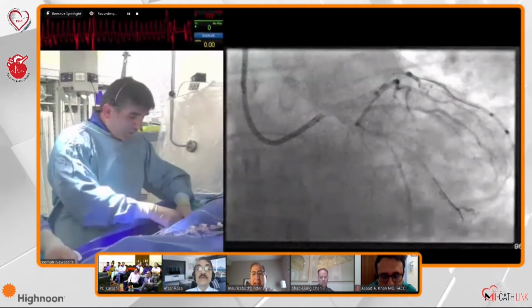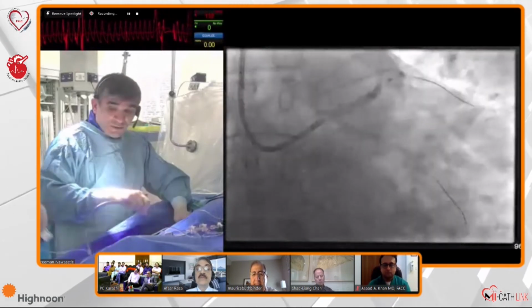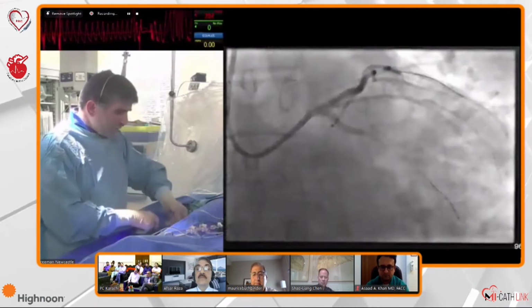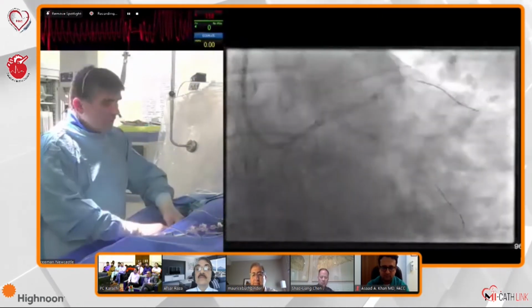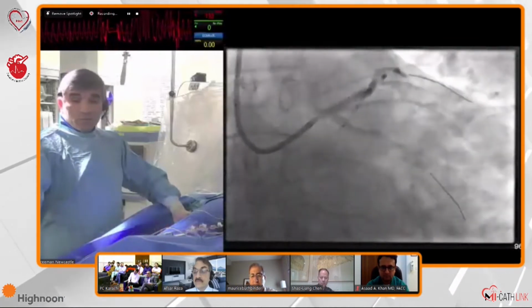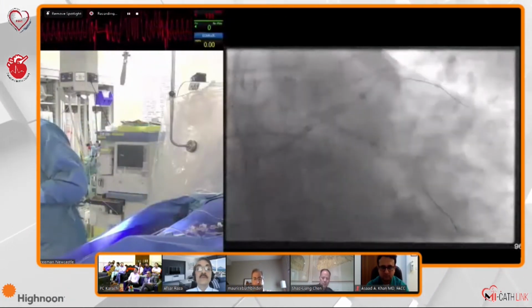Okay, good. Do you have an NC? Did you put it with an NC? That is an NC. They went to 20 atmospheres and rupture. So I'm going to take the angioscalp again and do the left main, and then we'll take a stent because I think it's ready. The stent will take the 3.5/10.